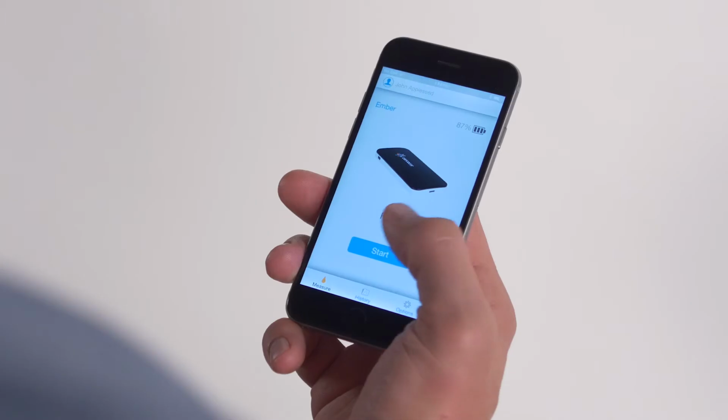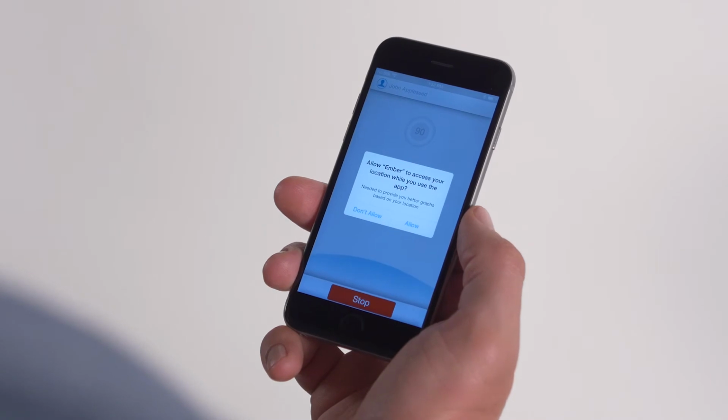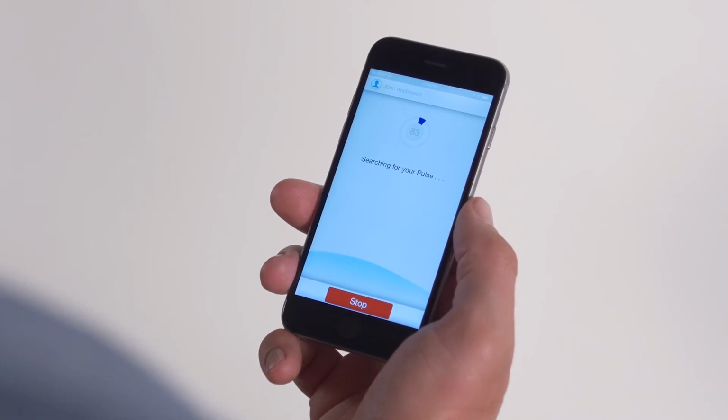Don't move, talk, or cough during your measurement. When you're ready, tap the Start button. The measurement should take 90 seconds or less. The system will ask you to try again if it cannot get a result. Remember, remain still during testing.